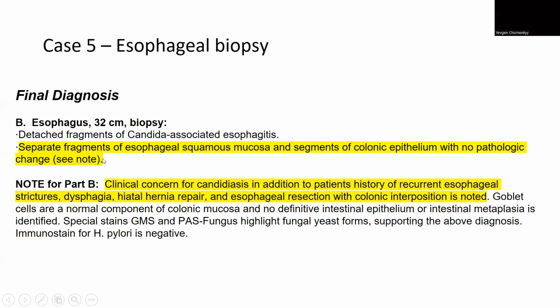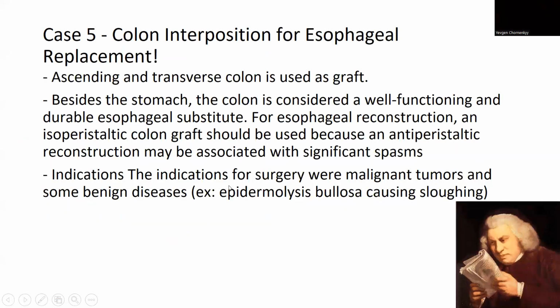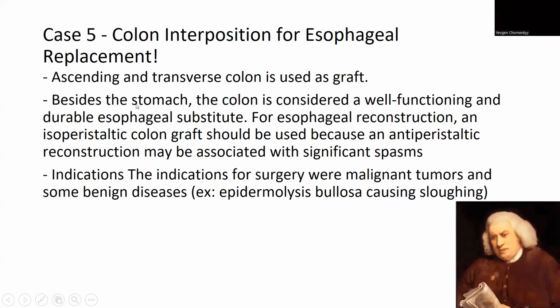There's candida there, but it was also some squamous mucosa with segments of colonic epithelium. And then we kind of mentioned the patient's history. We did the workup for fungus, and there was some candida.